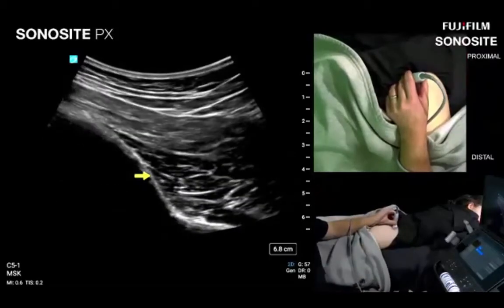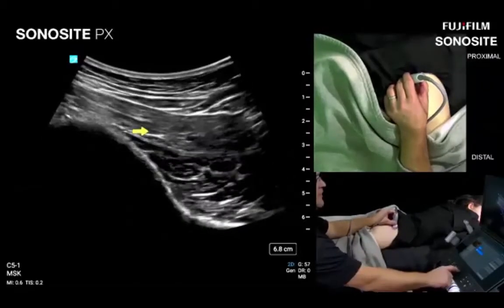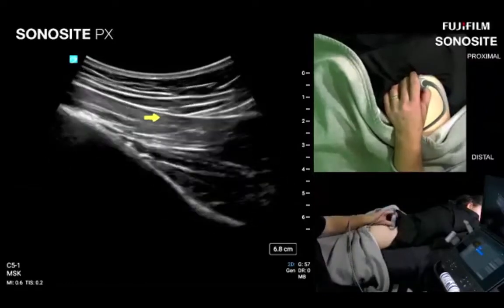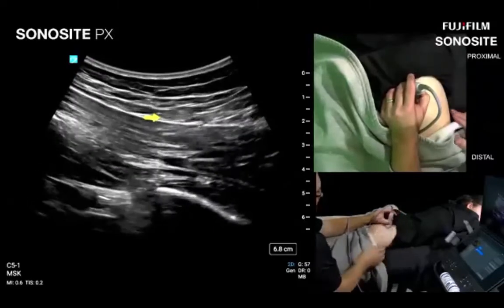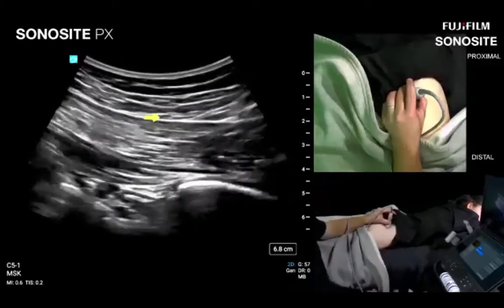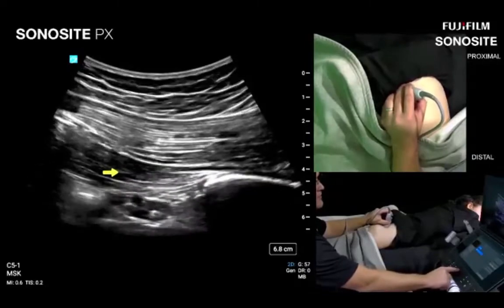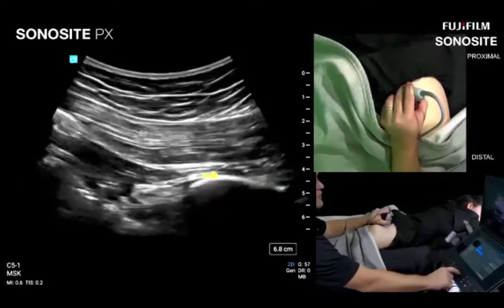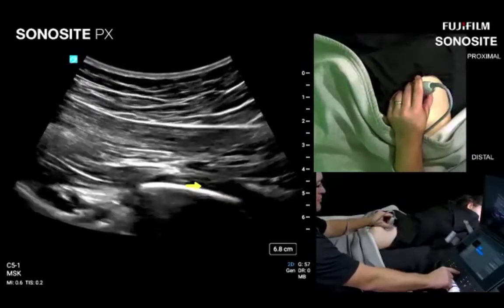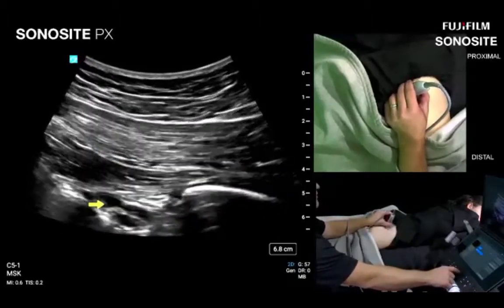Palpating the trochanter and aiming right at it helps orient correctly — the piriformis is not horizontal but a very much vertically oriented oblique structure. Here we have the glute max in long axis, piriformis in long axis, and you can see the central tendon of the piriformis beginning to show as we get over to the ischium. Superior ischium is here; right on the upper margin is the superior gemella. With more penetration from the lower frequency curvilinear transducer, the inferior gluteal artery and sciatic nerve are nicely visible deep to the piriformis.